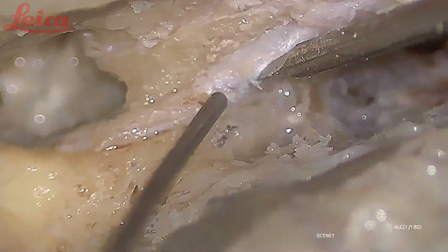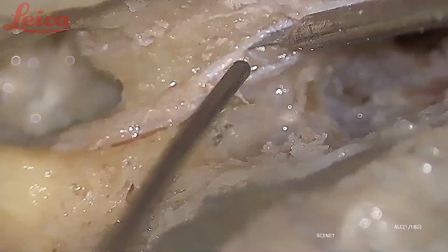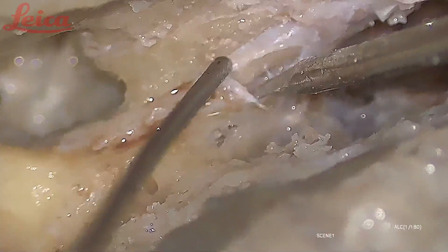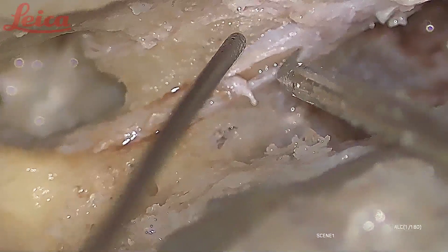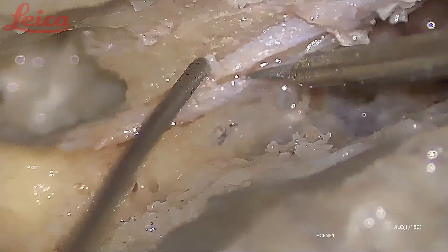Now you can see it is a very thick sheath here. What you are seeing is the healthy perineurium — what I am incising is the epineurium, and what you are seeing inside is the healthy perineurium. In case of Bell's palsy, this epineurium becomes even more thick, and it becomes very difficult to incise — we have to use iris scissors sometimes to cut the sheath because it becomes so inflamed.